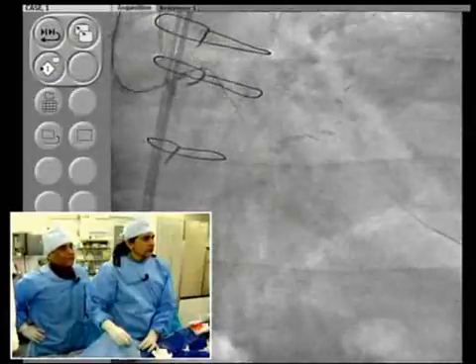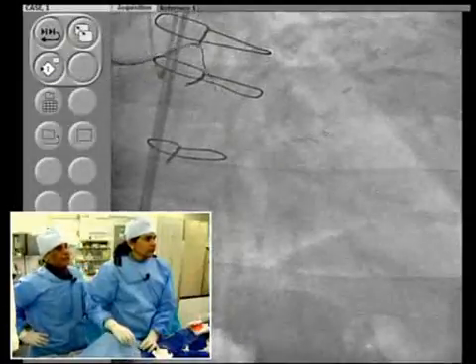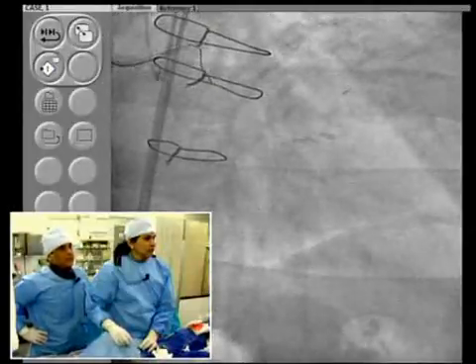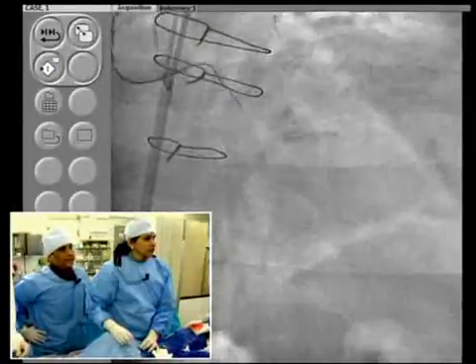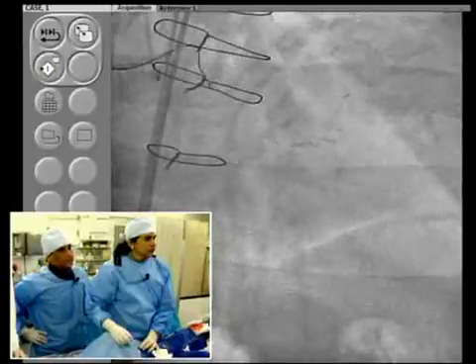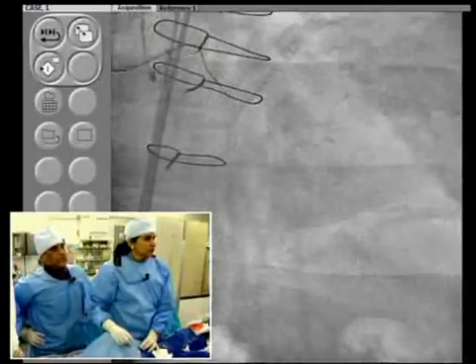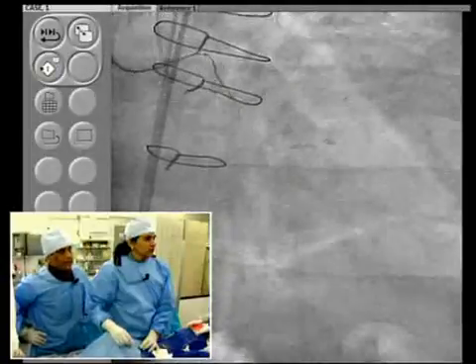Default in the sense that the cases did very well even after a wire perforation, and we are just talking about the fact that in a CTO you will usually get only wire perforation. Those patients did extremely well compared to when they used to be on heparin, and of course most of the time you end up reversing heparin and it still happened.